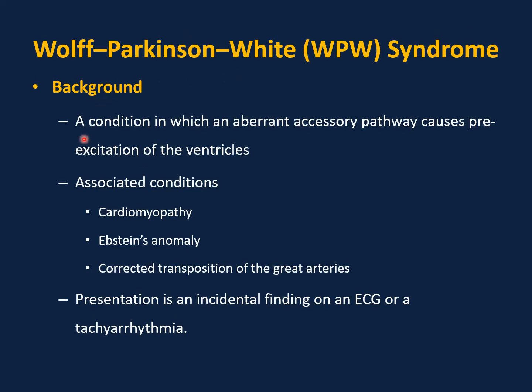Wolff-Parkinson-White syndrome is a condition in which an aberrant accessory pathway causes pre-excitation of the ventricles. Associated conditions: cardiomyopathy, Ebstein's anomaly, corrected transposition of great arteries. Presentation is an incidental finding on an ECG or a tachyarrhythmia.